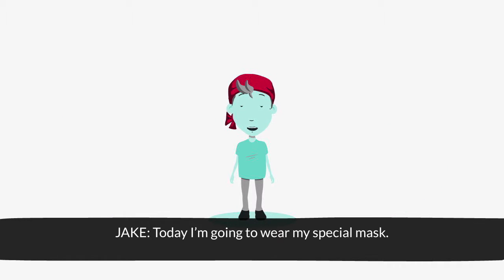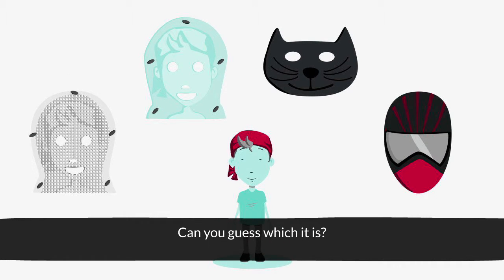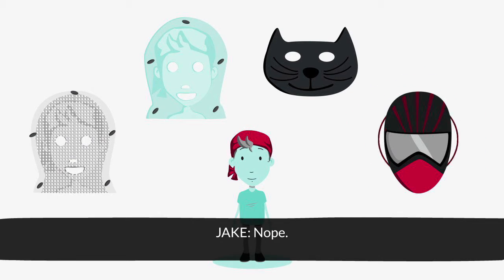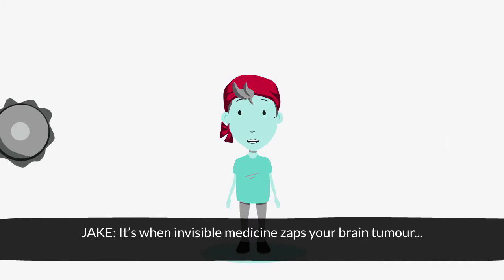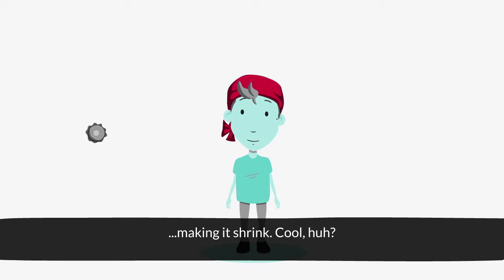Today I'm going to wear my special mask. Can you guess which it is? That one? Nope, that one. It's my radiotherapy mask. Radiotherapy? What's that? It's when invisible medicine zaps your brain tumour, making it shrink. Cool, huh?